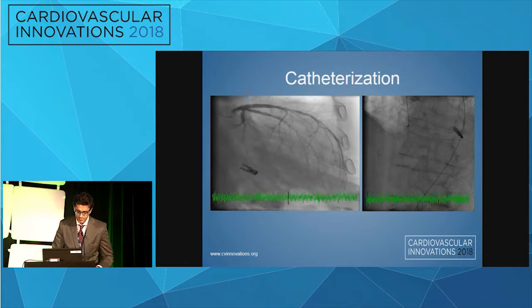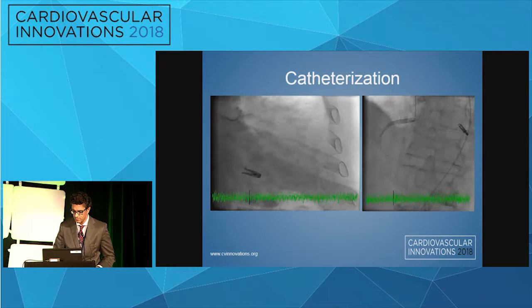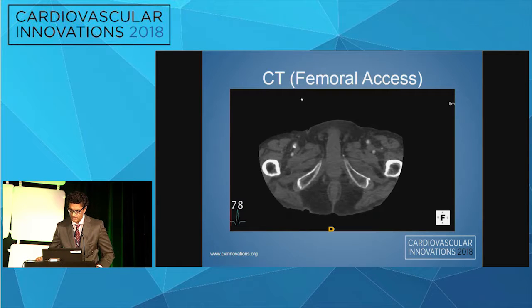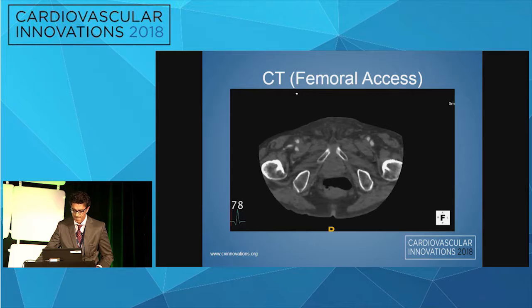This is his pre-procedure angiogram, with no evidence of obstructive coronary disease. And that's the CT scan to assess for femoral access.